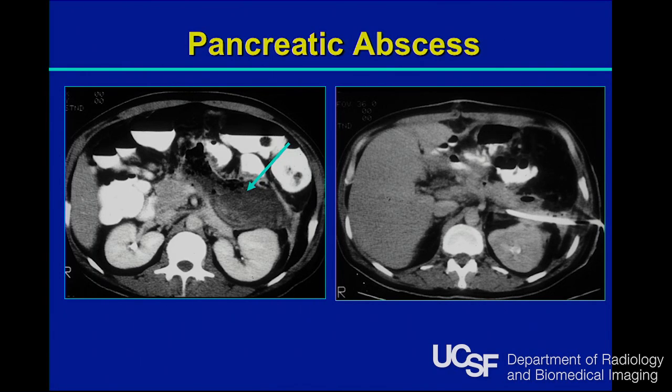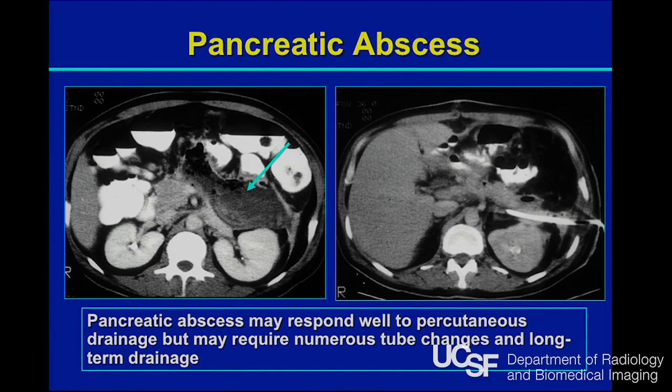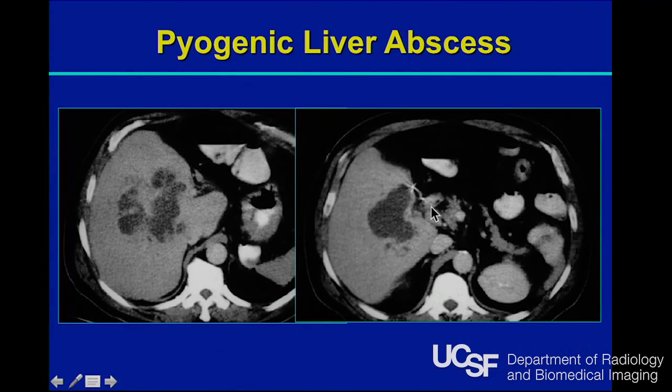The drains are going to be clogging up a lot, and these patients are going to be back weekly and sometimes even more often to have these drains adjusted and replaced. But it can be done without an operative approach in the cases of infected pancreatic necrosis.